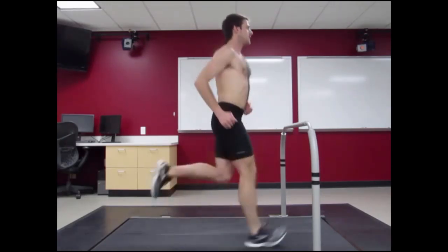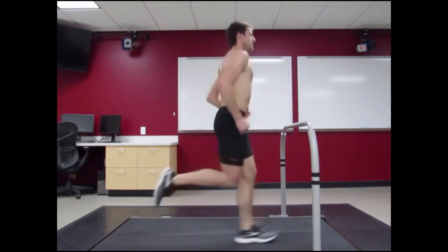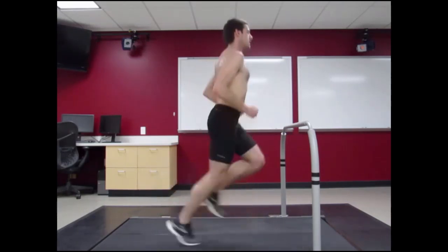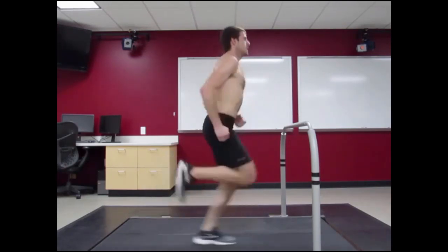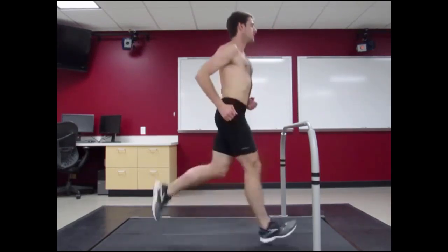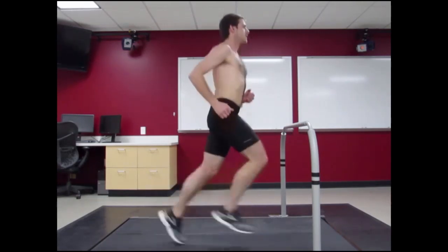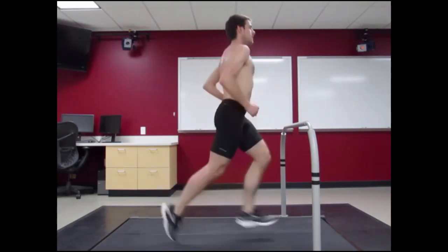When analyzing a person's running gait, it is very important to use a video camera to be able to slow down the movement and look at the body's posture at different portions of the gait cycle. As we can see from this sample video, trying to do so with just simply watching the person move and trying to estimate where the point of contact is occurring on their foot and what their knee angles look like and other aspects of their joint kinematics becomes very difficult because the angular velocities are so high.